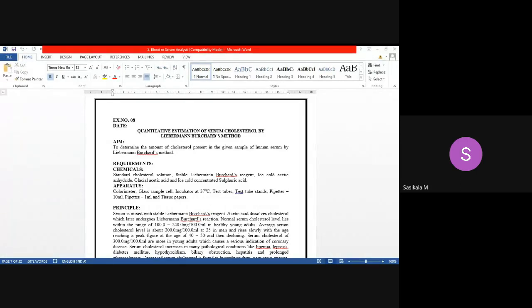Whether you are getting my voice clearly? Yes, ma'am. Okay, thank you. Then we'll proceed. The aim is to determine the amount of cholesterol present in the given sample of human serum. The amount of cholesterol is going to be determined by using Liebermann-Burchard's reagent method.